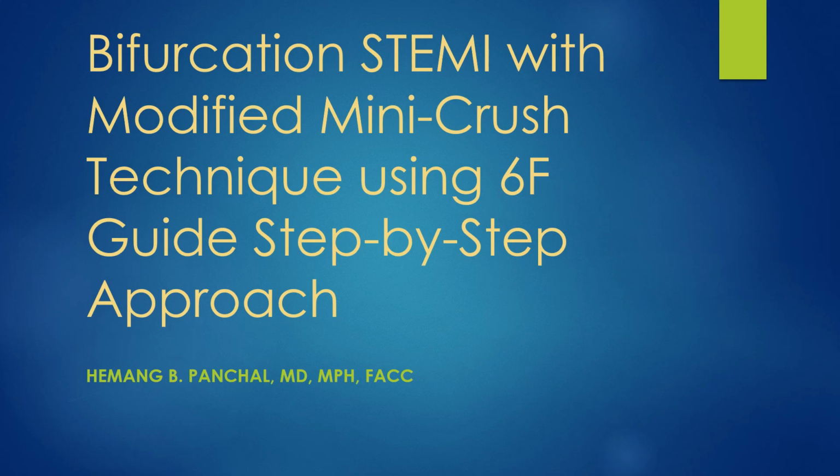This is Hemang Panchal. Today we have a case of bifurcation STEMI with modified mini crush technique using a 6 French guide, a step-by-step approach.